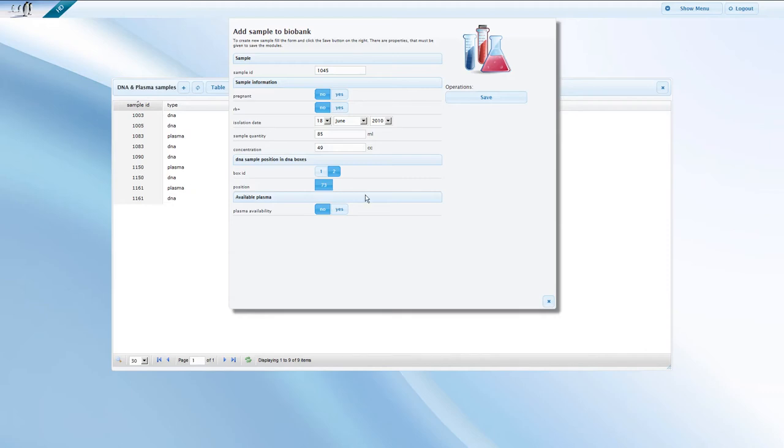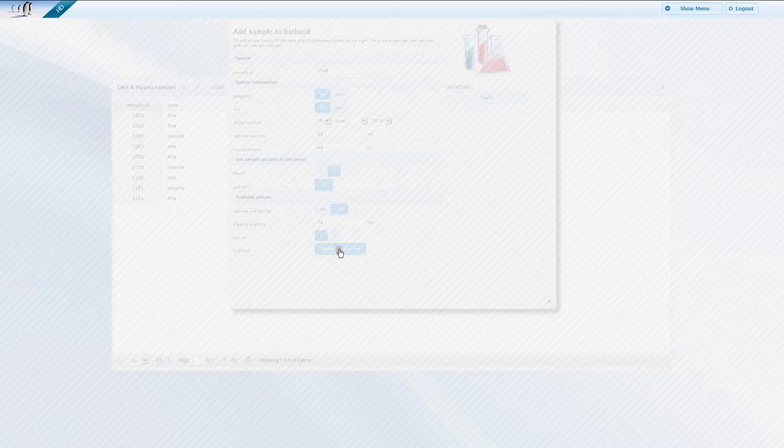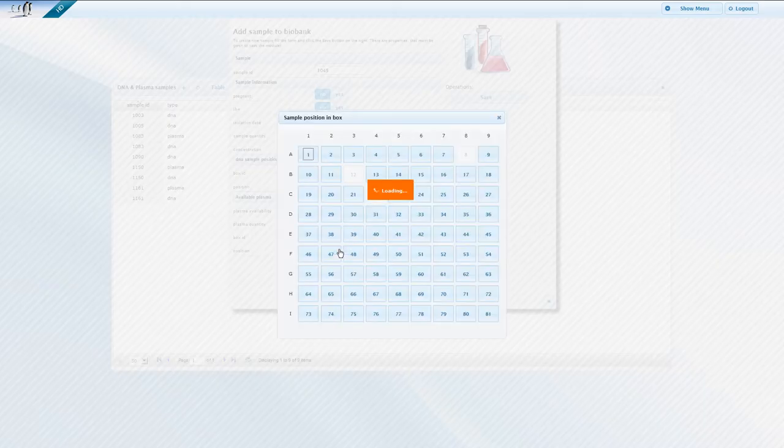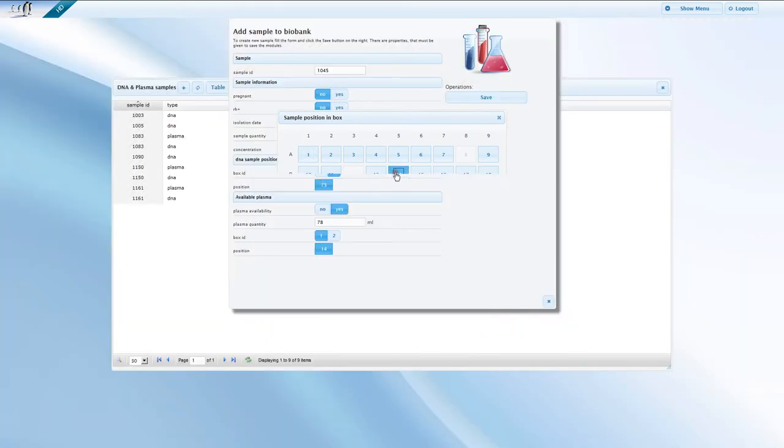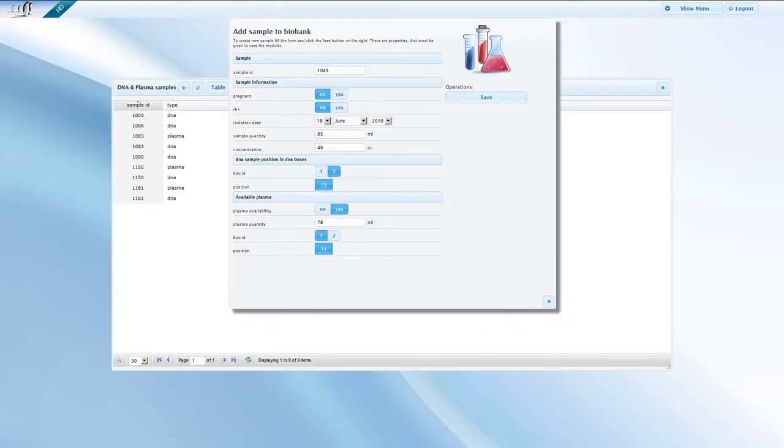In most cases, only part of the sample is used for a particular experiment. The rest will be stored in another container. SmartBank lets you allocate a position to the remaining quantity right away. When you have finished entering the information, simply save the form.